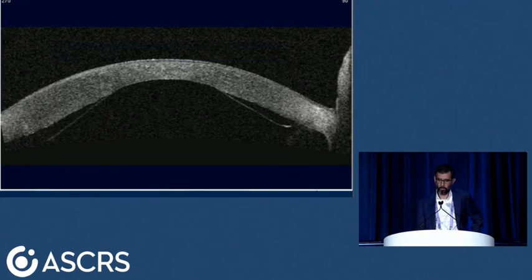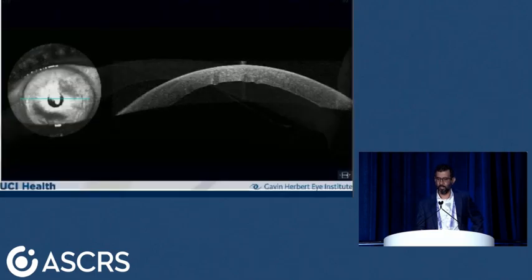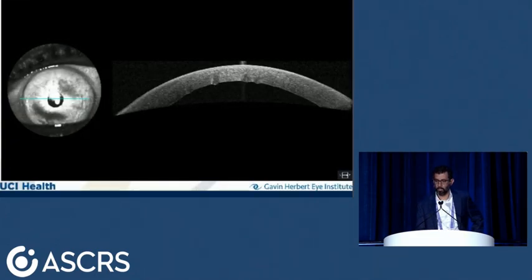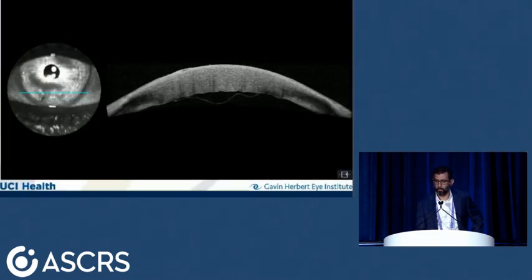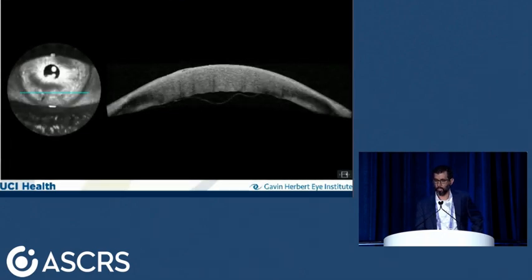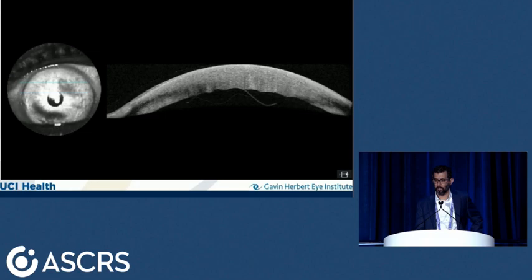This one came from Dr. Chamberlain at OHSU. This one you can see here, that patient, go back. This is another patient, there's a detachment here. With the anterior segment OCT you can see serially, centrally attached, peripherally not so well attached. This is that same patient, different images, different areas of the cornea, just to show this was a diffuse detachment. So we felt we wanted to go in and rebubble here.